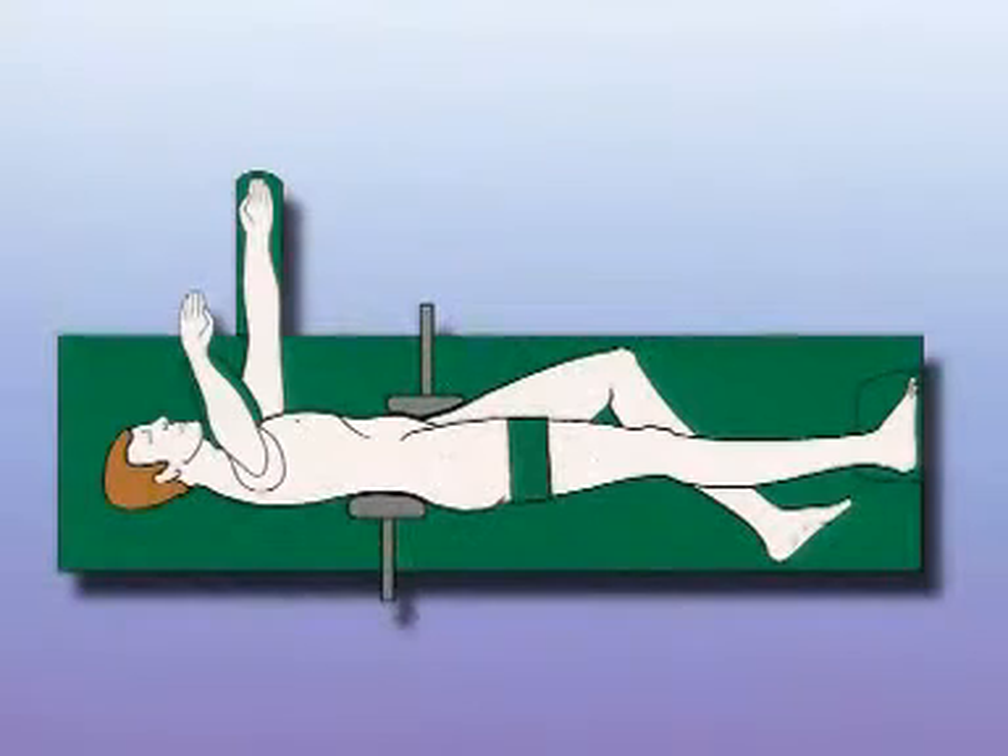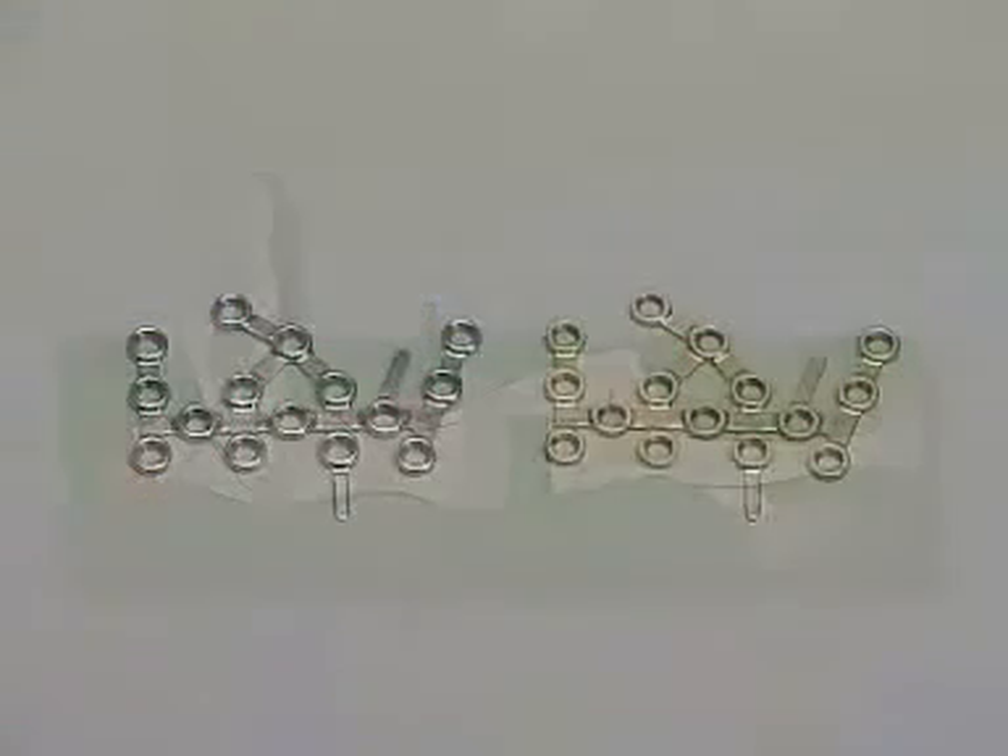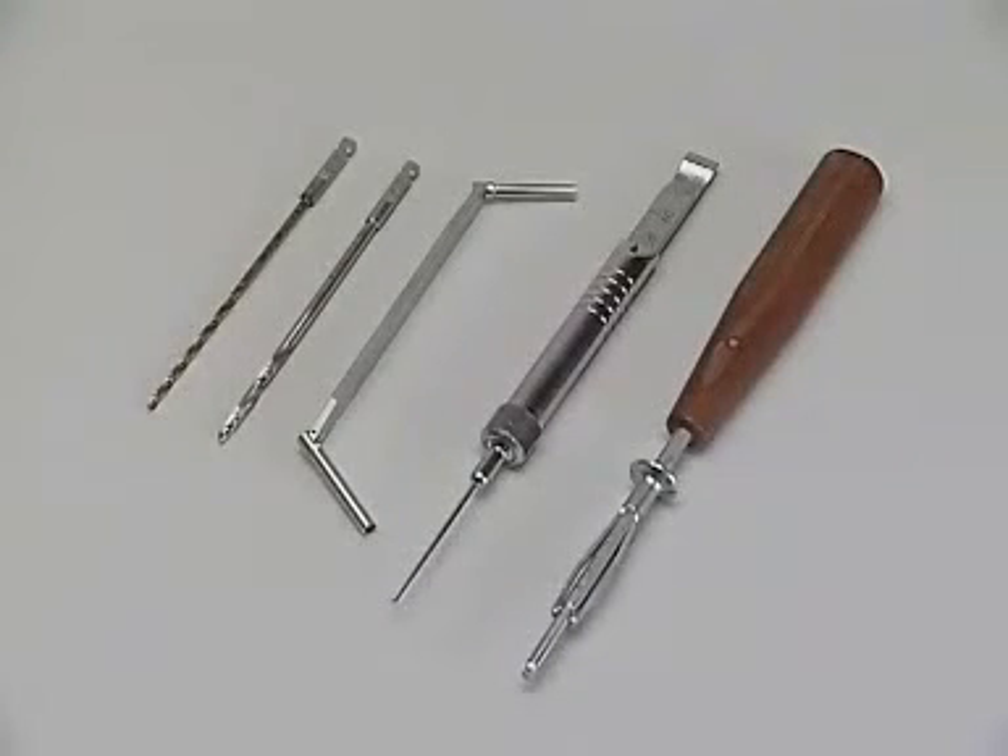The patient is placed in the lateral decubitus position. The calcaneal locking plate is available in steel and titanium. It can be used with any combination of 2.7 and 3.5 mm self-tapping cortex screws, with 2.7 and 3.5 mm self-tapping locking head screws. In this exercise, the 3.5 mm cortex screw is used.